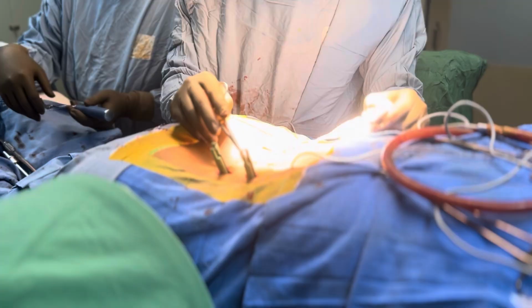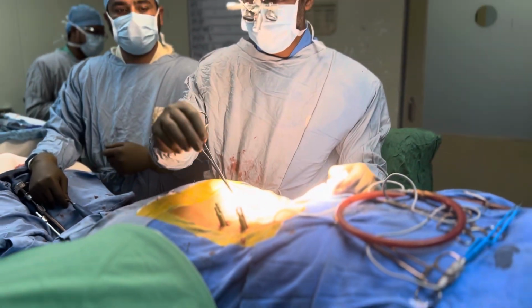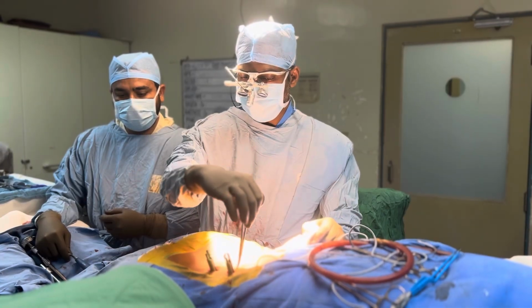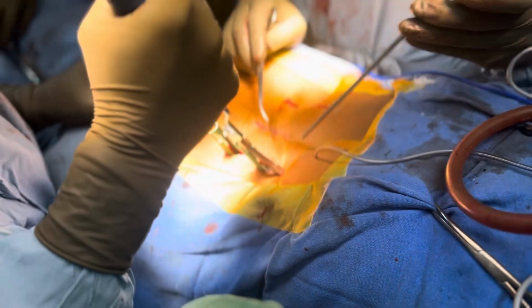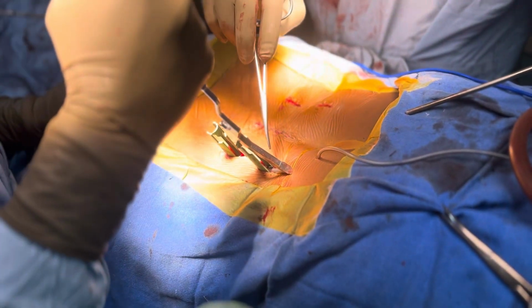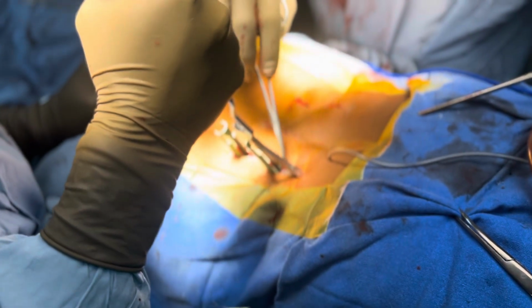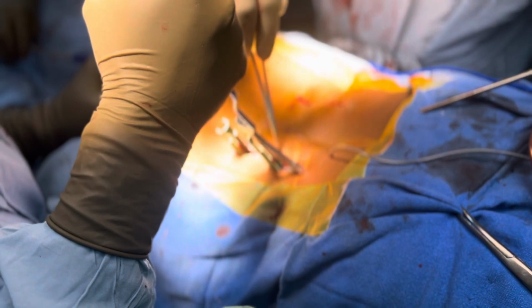But to put the rod, I need to come on the right side. It is not possible to put the rod from the left side. So I am going to come from the right side and then put the rod. While putting, the rod should go below the fascia which is in between the two screws. So while inserting it, the tip should go below the fascia and then you should insert it.